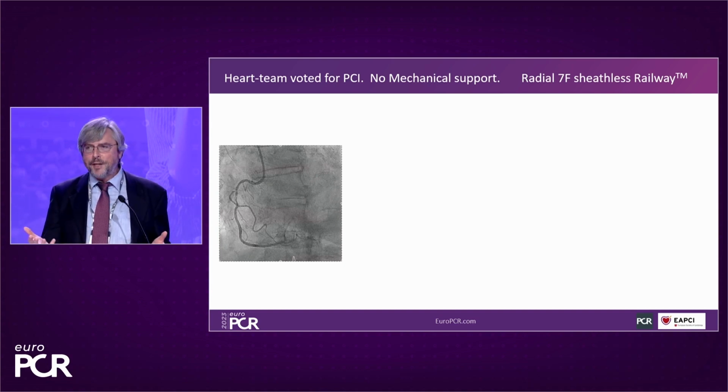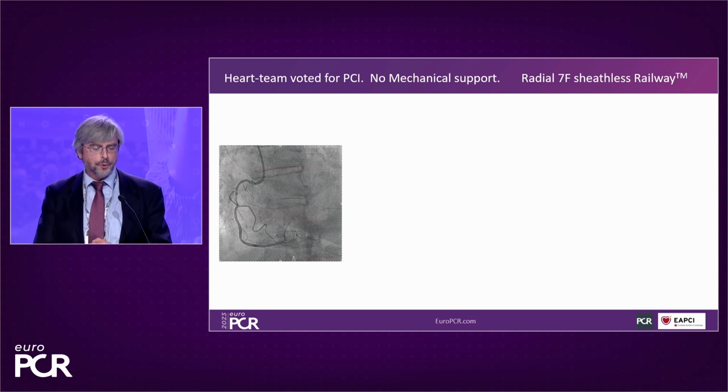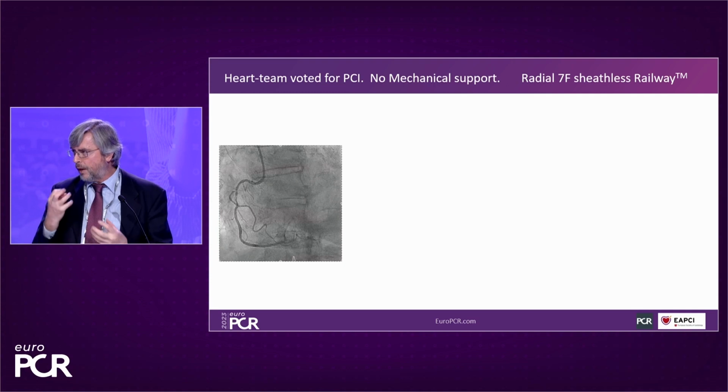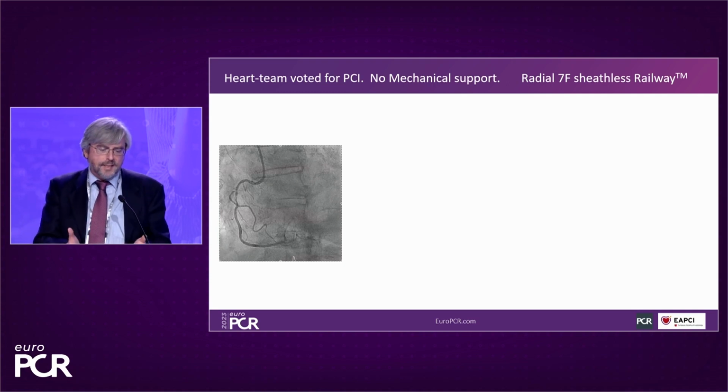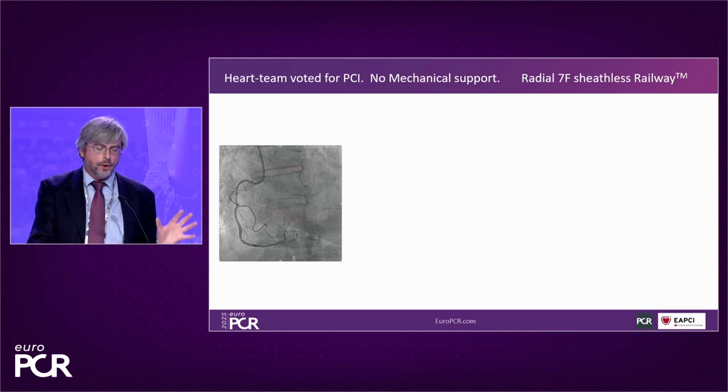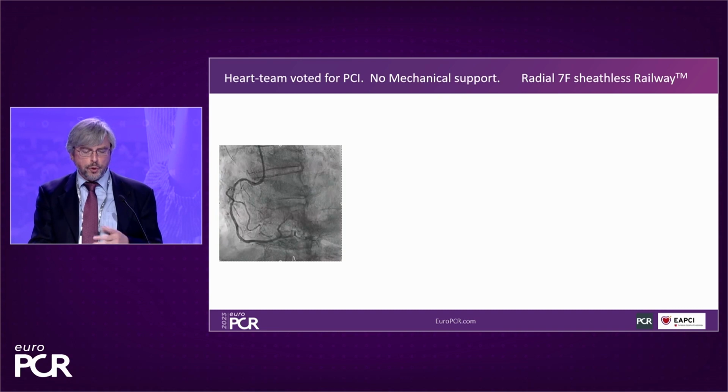So what would be the strategy now? If I get the case back now, nobody really wants to do it. I think, what can I do to better the perfusion in this well-functioning heart? And I see this rather simple stenosis in the right, and a lot of the circumflex depending on that also by collaterals. So I decided to do rotablation on that right artery.